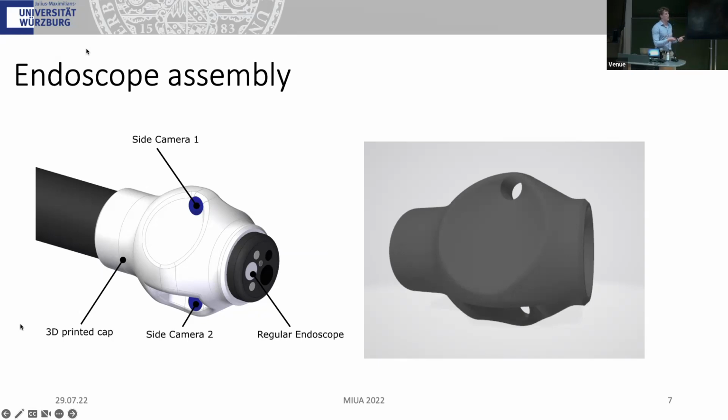So the trial was in pigs, so it was kind of a strange scenario too, because normally gastroenterologists don't work in pigs. So also Alexander Meining, who was the professor doing the actual intervention in the end, had to rely on a system which is really good and was working while he was in this environment. So yeah, we have those 2 holes, and then we have the setup which was 3D printed, and we got it all running so that those cameras are working.